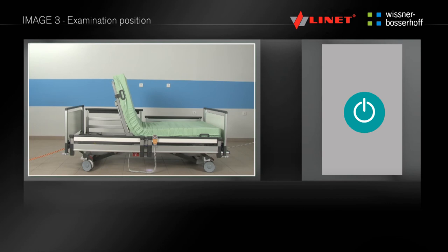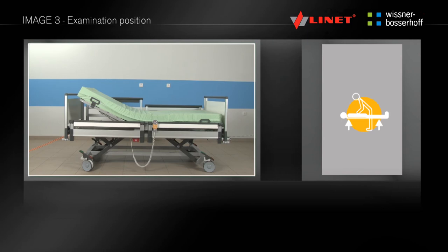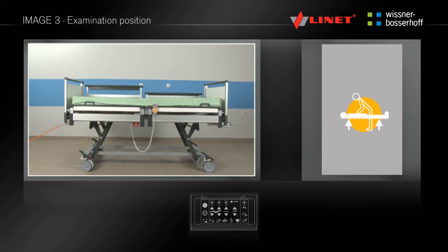By pressing and holding the button, you can set the examination position. The backrest and thigh rest are positioned to the horizontal position, and at the same time the bed is positioned to the highest position. This function can be found only on the supervisor control panel in the area of pre-programmed functions.